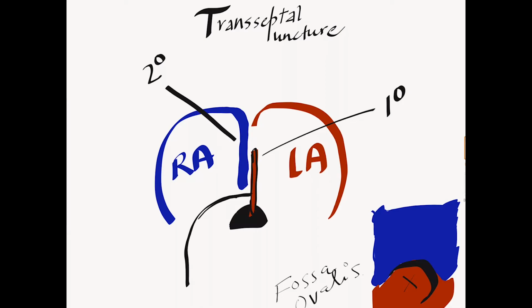Now let's bring your needle, which you're going to use to cross the septum. So this is your system which you're going to use to cross the septum. That's the thinnest part. That's why when you press on it, it tents. So if you are trying to cross the septum, for example, you're here, your device may not help tenting the septum because it's too thick a part. So if you're pressing and the septum is not tenting, you're on the wrong part of the septum. You're not in the fossa ovalis where you want to puncture.